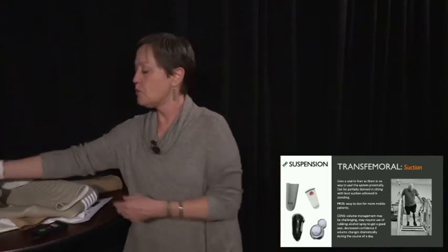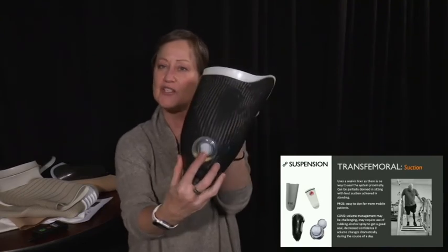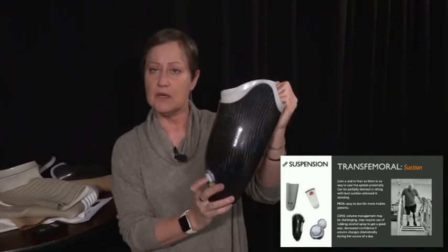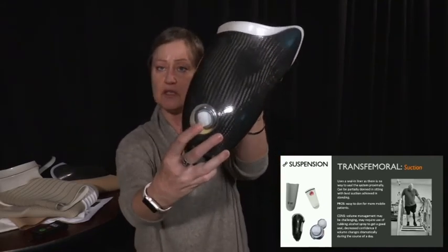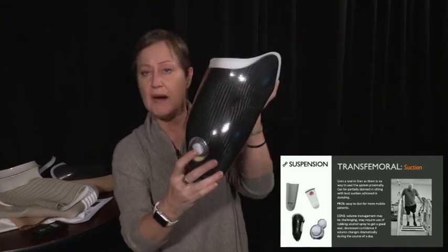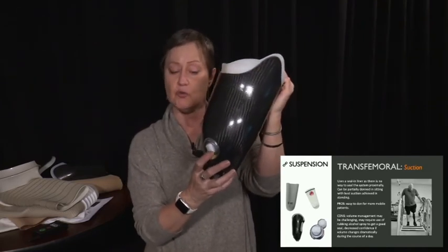So here's what's interesting about the transfem patient for the suction. They also have a valve. And this valve, they'll don the socket, they'll stand up and push, and every time they put some body weight on that leg, they mash. There's a little button right in the middle. They mash the button, it lets air out. It's still a one-way valve. They release. They put body weight on it, they mash the button, release some air, and they do that a couple of times until they really feel the suction is great.